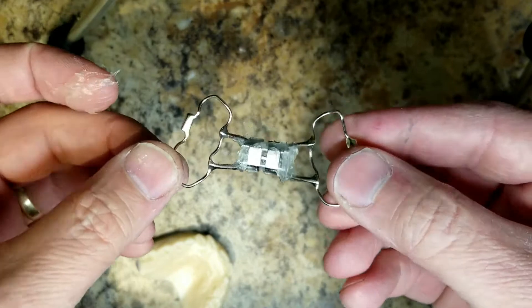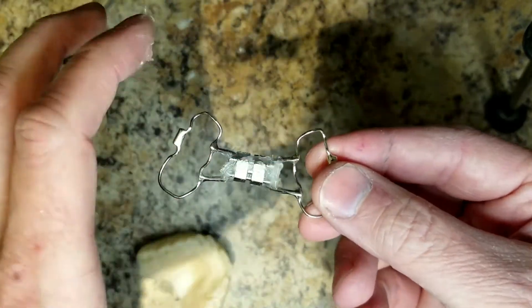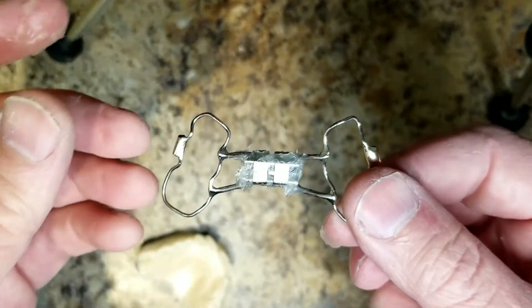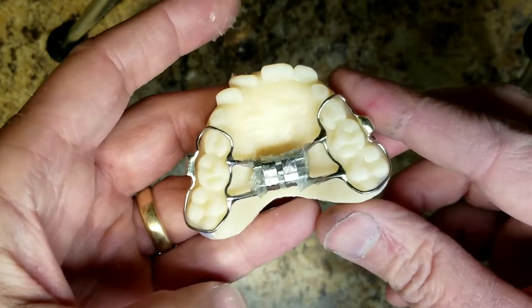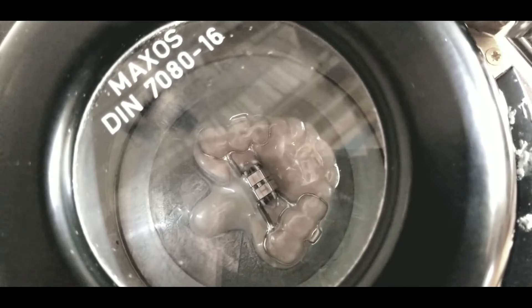Now the screw is protected. When you thermal press onto the expander, the screw will be completely protected from the acrylic bonding to it. Let's go make this and I'll show you the results — I'll thermal press the expander, cut it out, and you'll see how easy it is to remove.